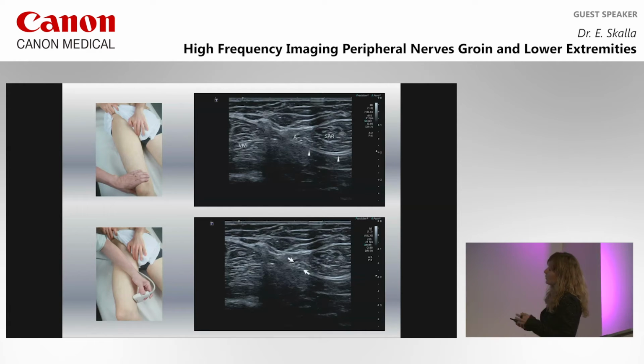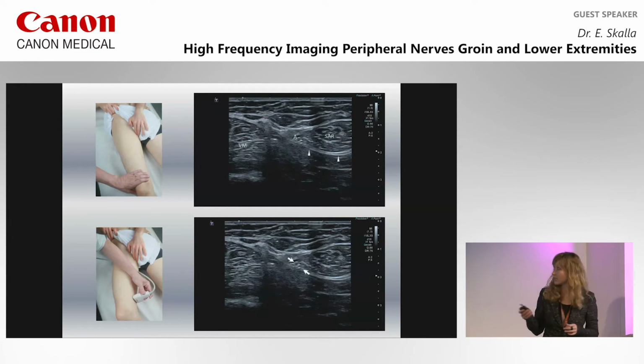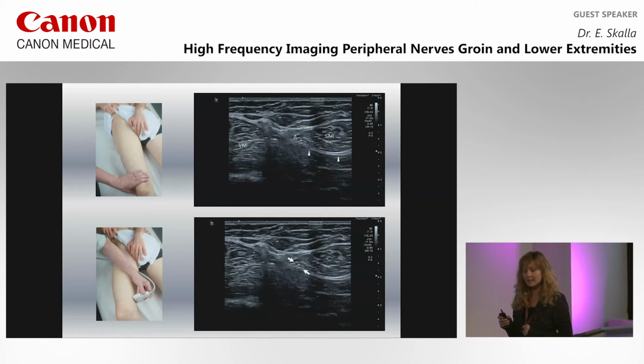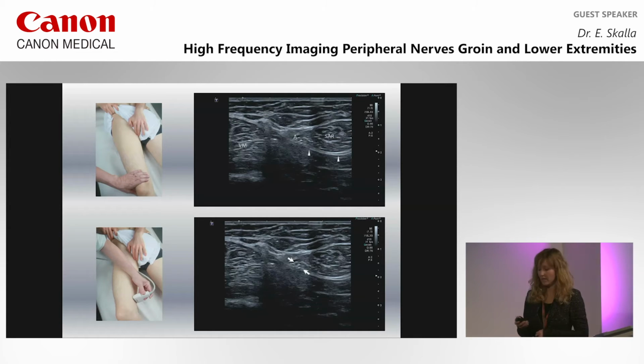As an internal landmark, you could also use the Doppler and see if there's an arterial signal. It would be the descending genicular artery, which can help you find the nerve because they pierce the vastoadductor membrane together.